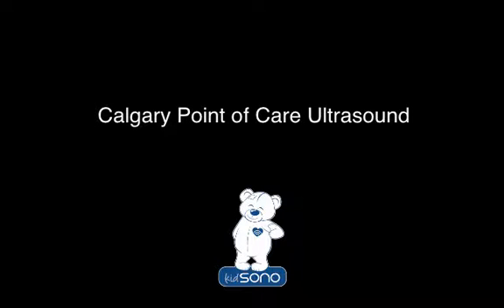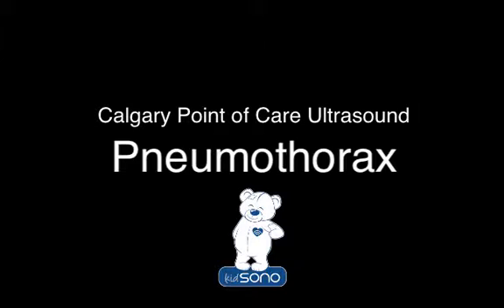Today we're going to run through a quick tutorial on how to assess for pneumothorax using point-of-care ultrasound.